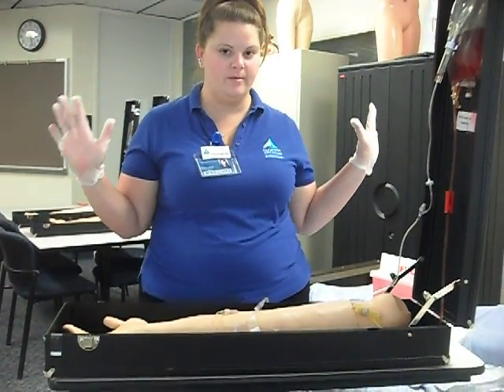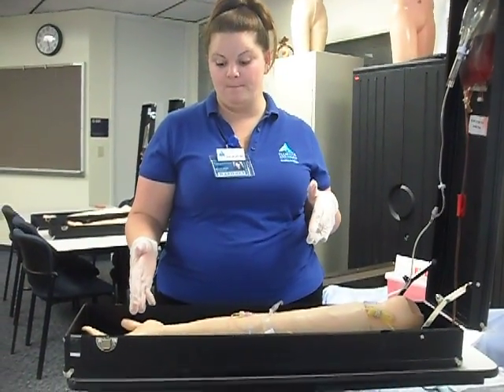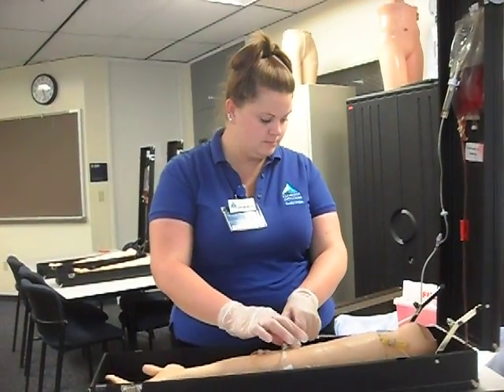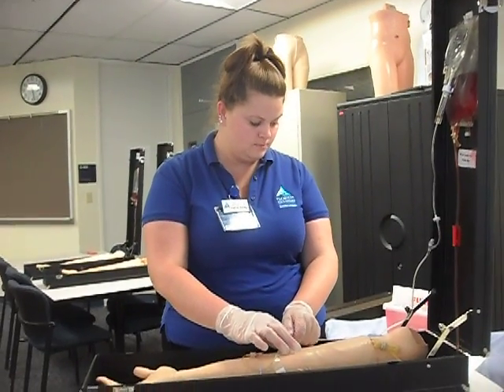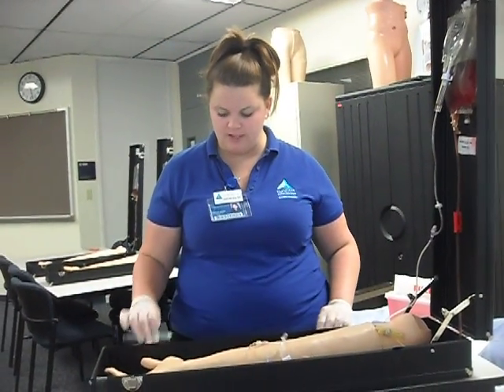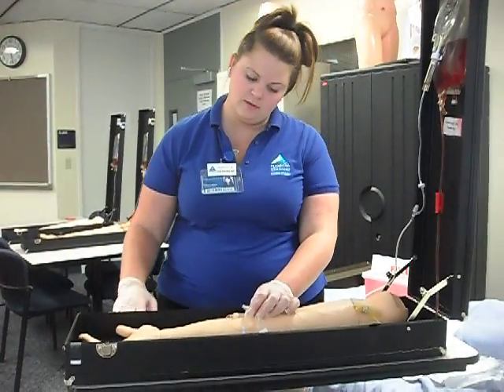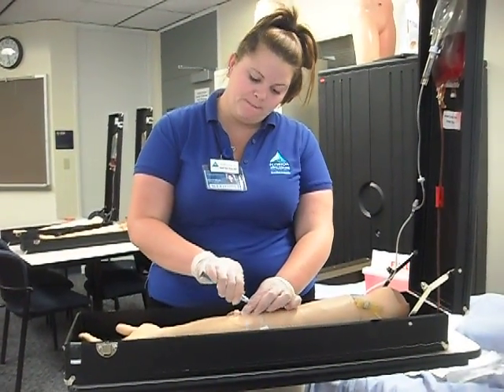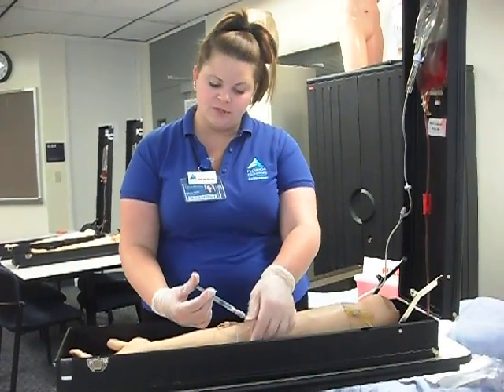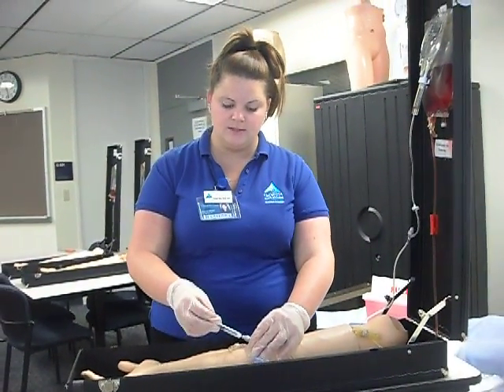First, I'm going to come in the room, wash my hands, and put on more gloves. ID the patient again. And I'm going to disconnect the site. And I'm going to take my pre-filled saline syringe and I'm going to clean it, attach it, flush it with the push stop method. With positive pressure, I'm going to clamp the site and disconnect the saline.